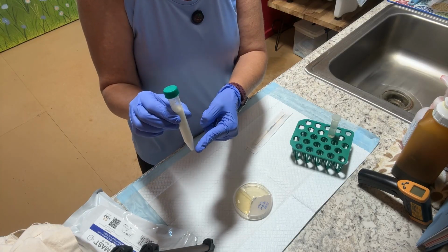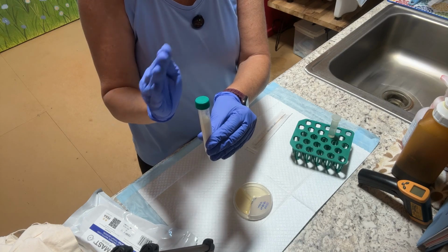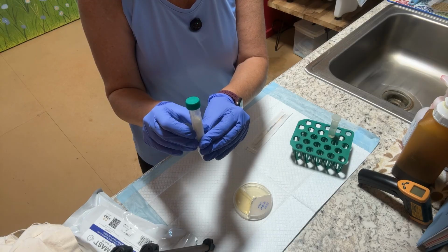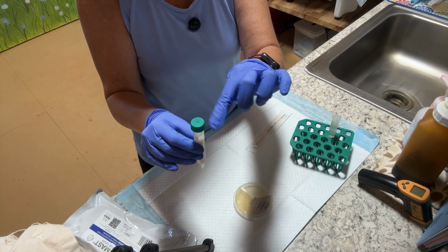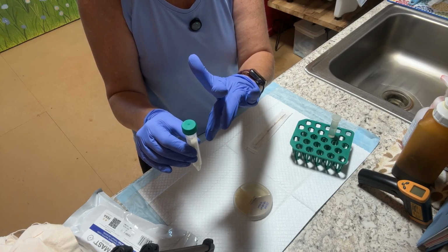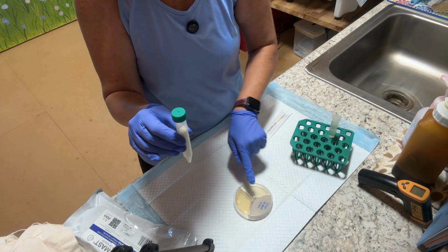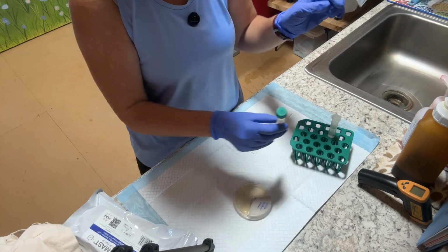This was collected in a sterile container, and I did clean the teat really well, and I was very careful not to contaminate the end of the teat after it had been disinfected. I took the lid off of this, being sure not to contaminate it, and squirted milk carefully down into this without contaminating the top of this. We want to keep this sample as pure as possible so that we don't get contamination in our little Petri dish. So I'm going to loosen this up.